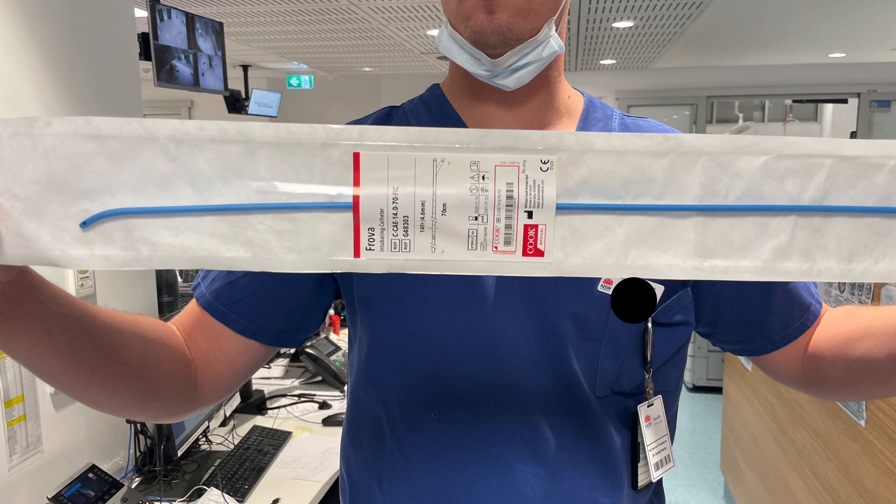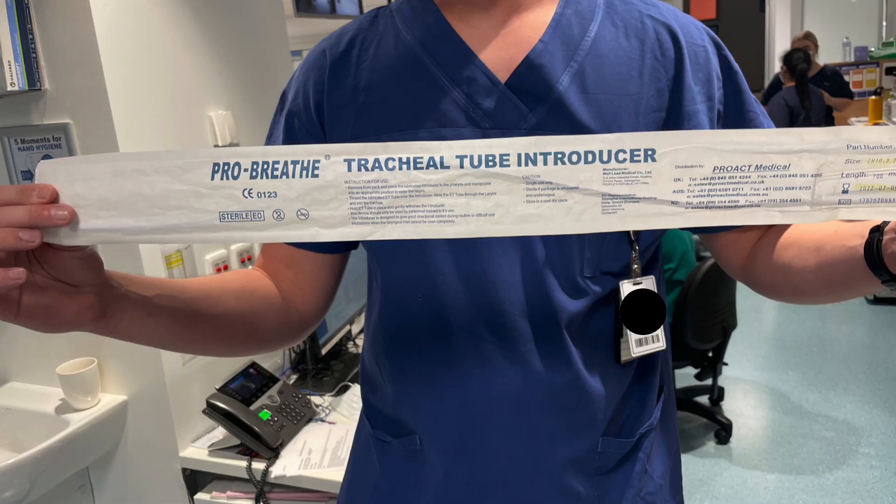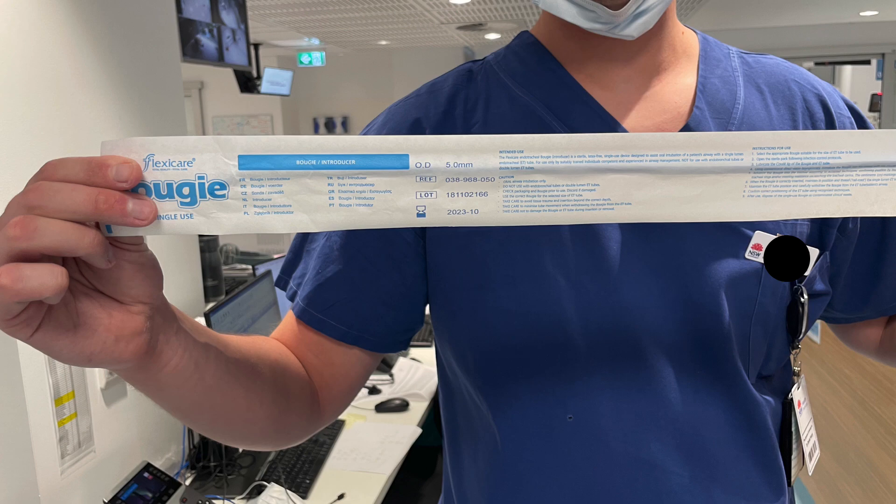The Frova bougie, or Frova intubating catheter made by Cook, is one that many of us are familiar with and would have trained with. But you can look around some hospitals and find alternatives that are also blue and look similar, like the ProBreathe and the FlexiCare.